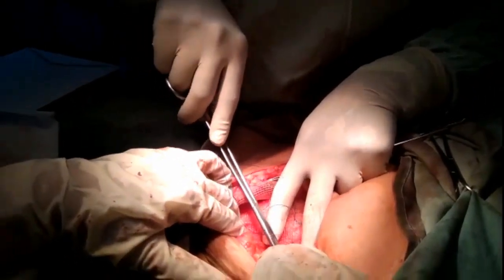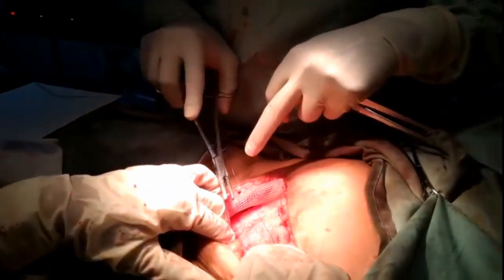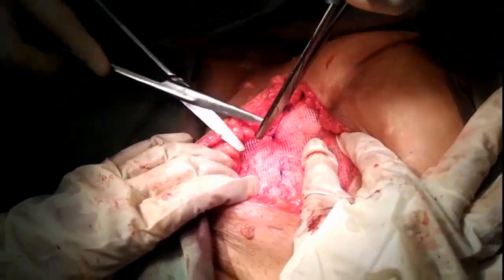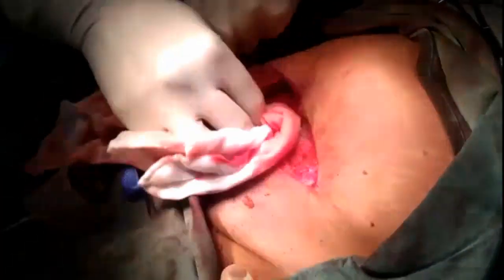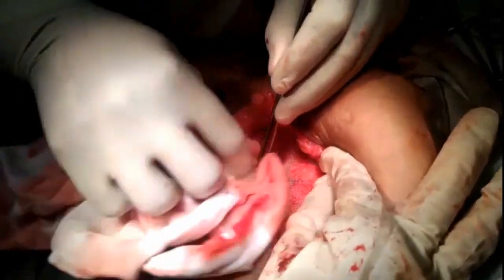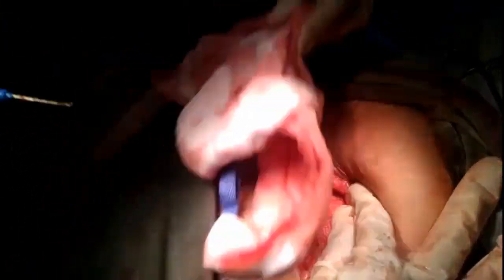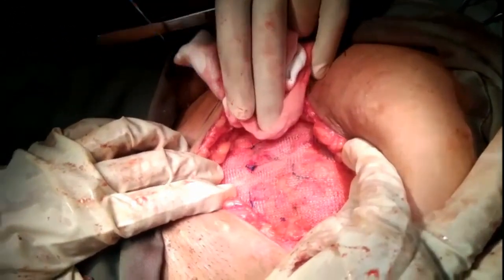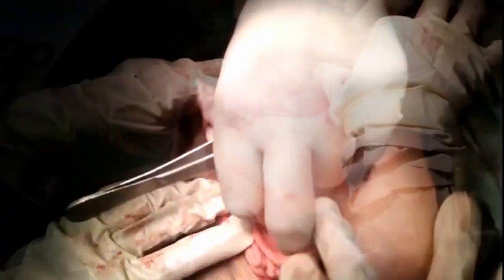With Prolene 2-0, with a 2 cm gap, you will apply stitches and cover all areas. Then, centrally over the defect area, you will apply continuous suturing with Prolene 2-0 in order to prevent herniation through the defect, because this area is weak and must be reinforced with the mesh.